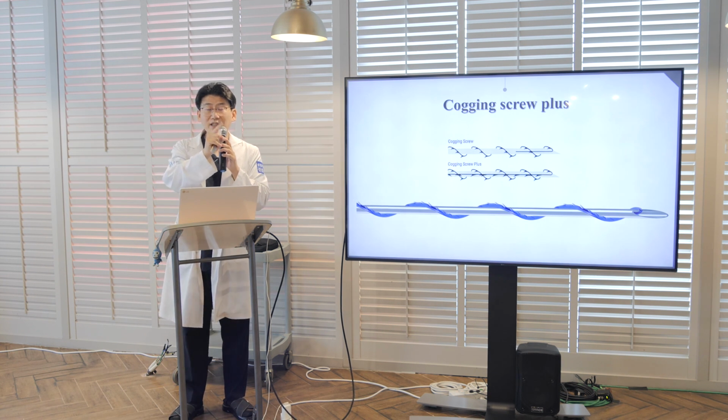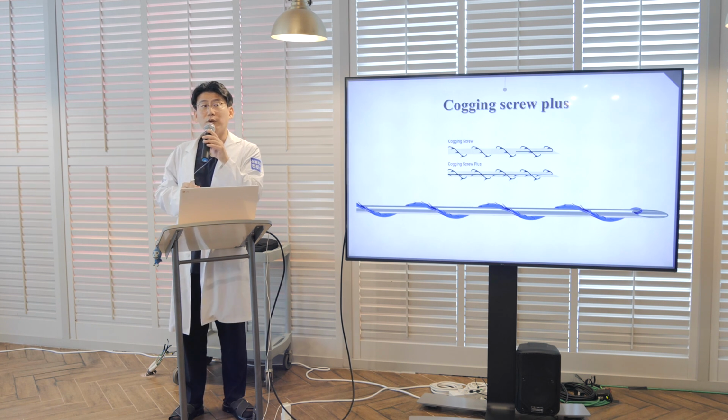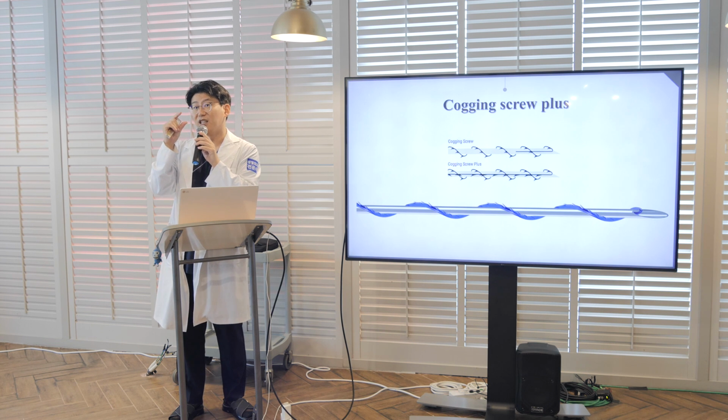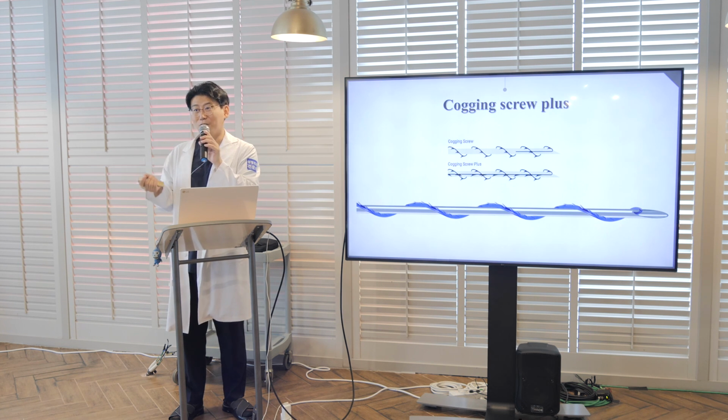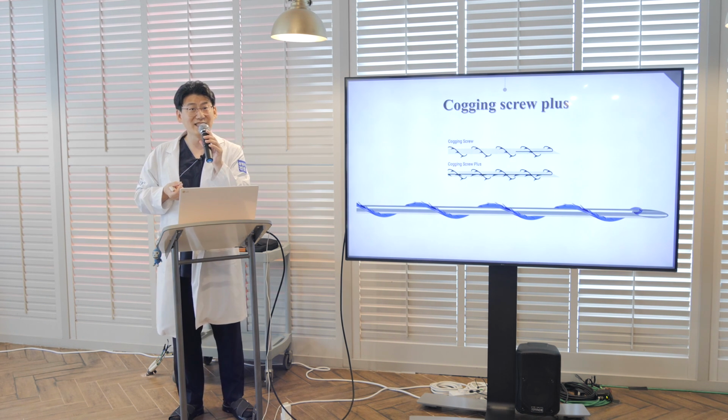Then number 1, number 2, number 3. With PDO, number 3 is the thickest thread. Till now it's not used for the human body, it's used for horses or cows. But nowadays we are using the number 3 thread as well for lifting thread.